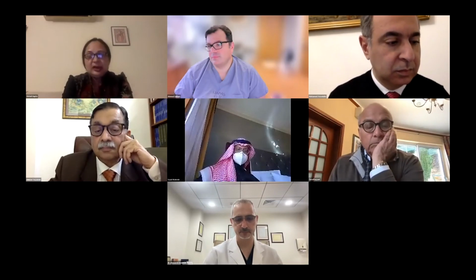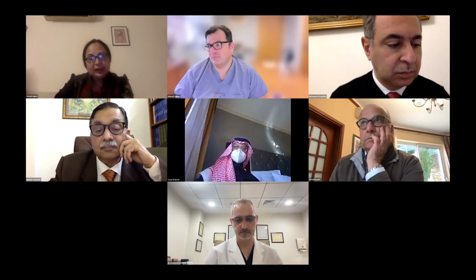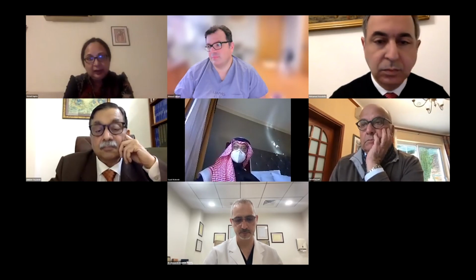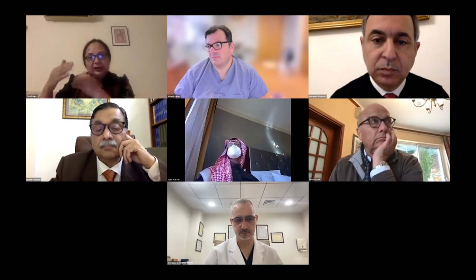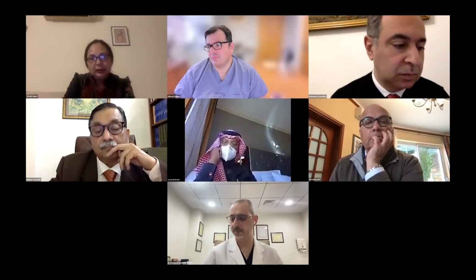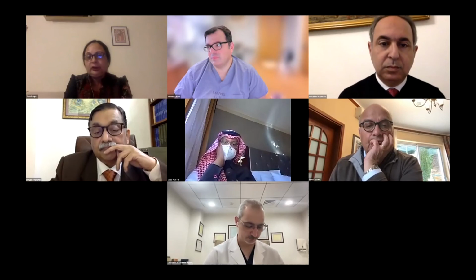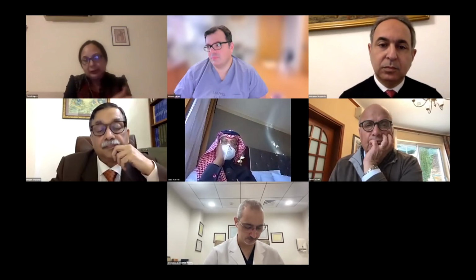I would use diamond dusted a lot here to peel off those membranes and take them to the edge, and then do the peripheral dissection. Even if I have a little bit of skirt left between the posterior pole and the anterior most part, which is not attached to anything, I would leave it and support it with a buckle, maybe.